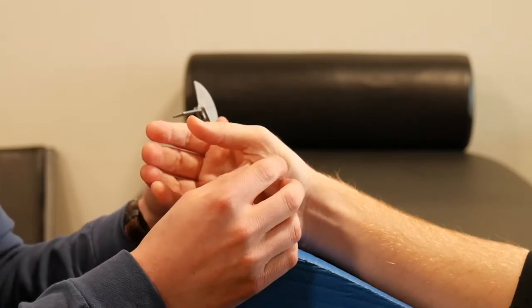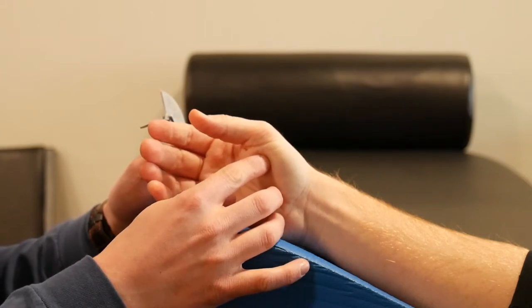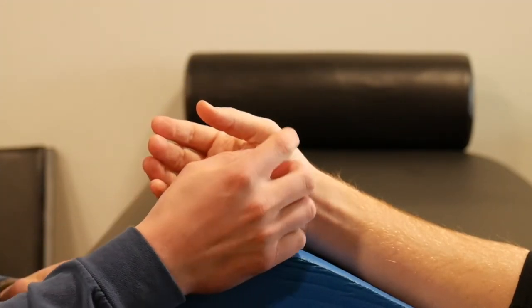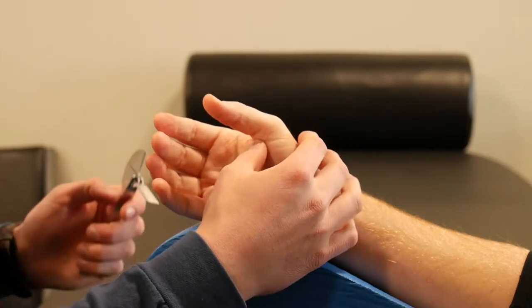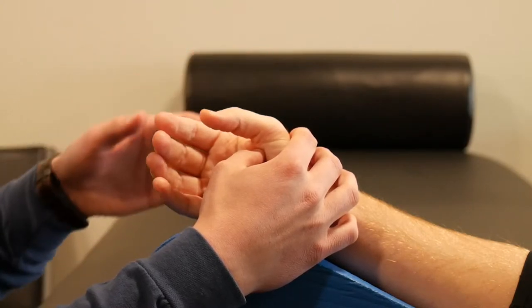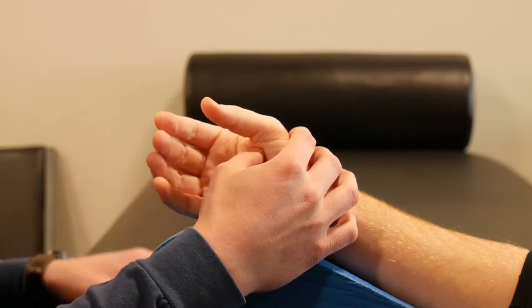I'm going to turn him on the edge of his hand — that's just the way to get it off the treatment table or wedge there to get his thumb free so it can move freely. We'll start with MP joint flexion. Obviously you can have them actively range first just to get a general sense of their range of motion.